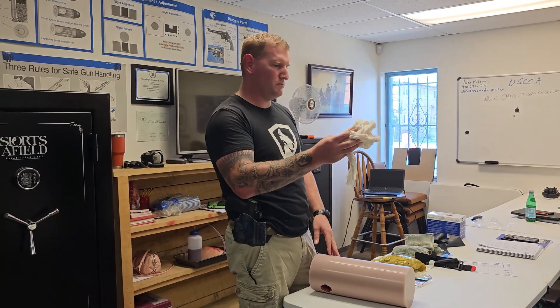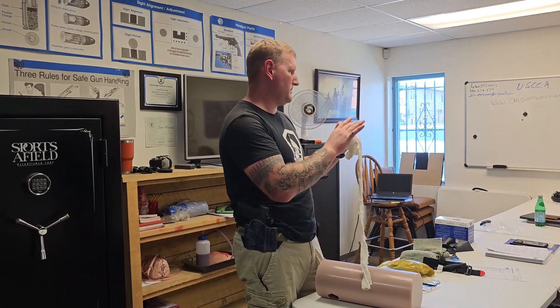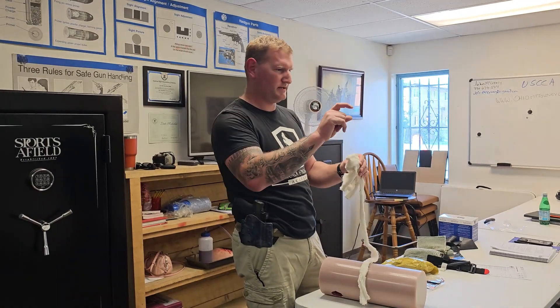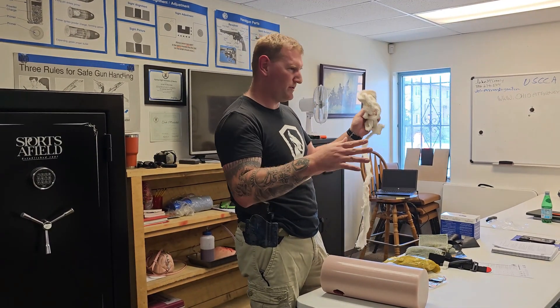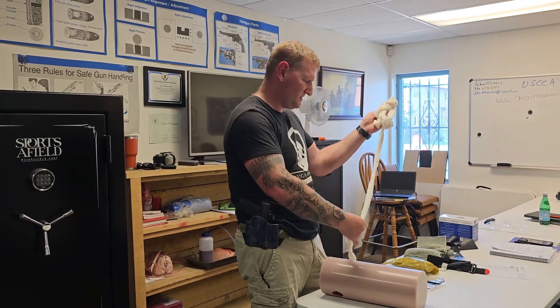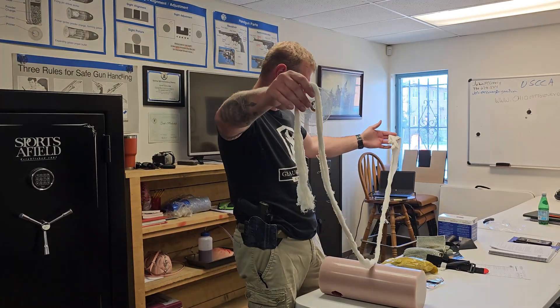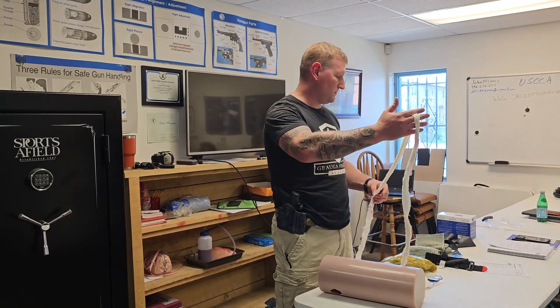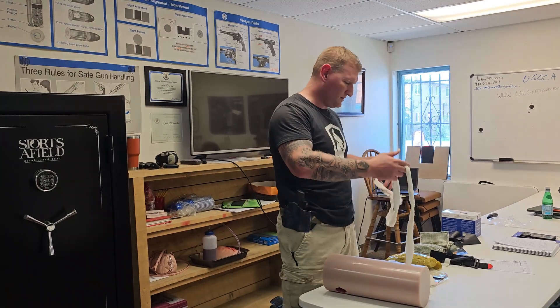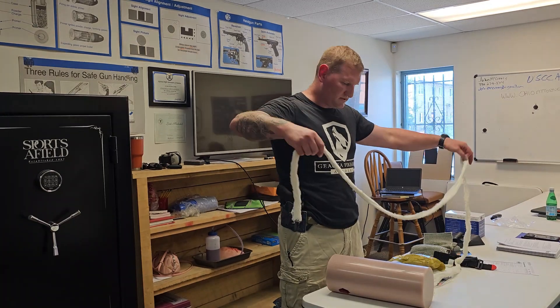One thing you're going to see is when you buy these, a lot of times you're going to get them in a compressed bandage that looks like a stack of business cards — it's super tight. It's usually around four yards give or take, and it will eventually expand all the way up to something like this.